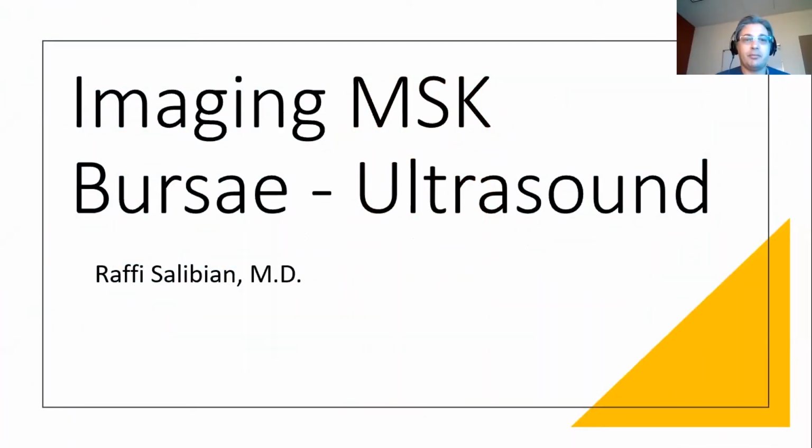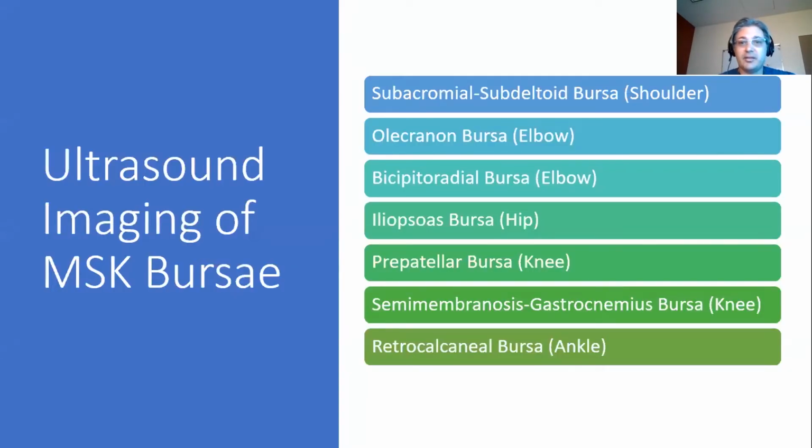Good morning or afternoon, everybody, depending on where you are. My name is Raffi. I'll be talking to you, as Daria mentioned, about sonographic imaging of various bursae that we see throughout the body. Let's get started. So here is a list of many of the bursae that we commonly encounter that can present pathologically as pain and inflammation. We'll be talking about from the shoulder down to the ankle.